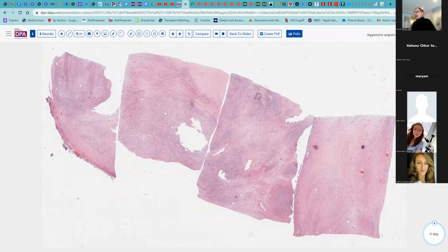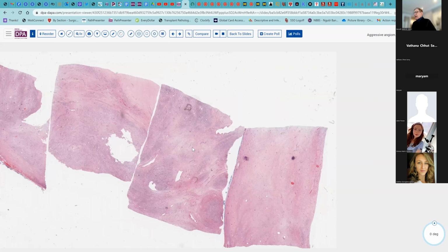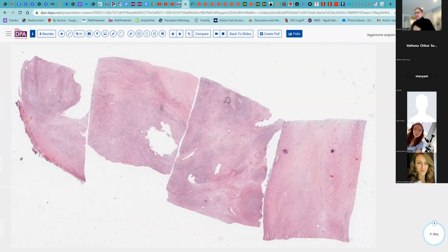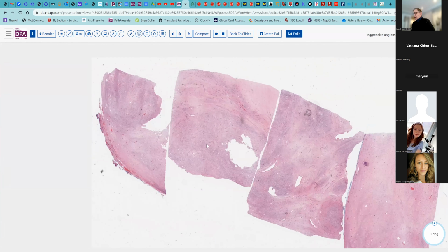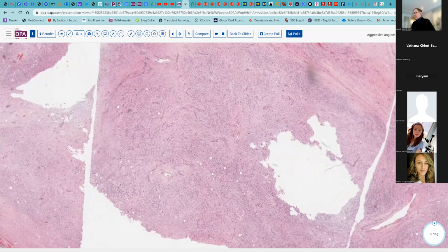some polyuria. And here you can see this is a not very cellular stromal lesion. It's got a degree of lobulation to it. You can see the nodularity that's present here. And I think you can even appreciate at low magnification that there's a mixture of vessels here.